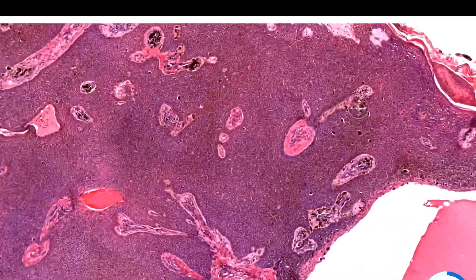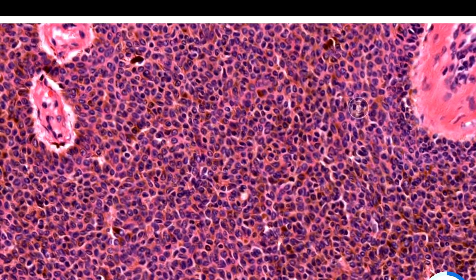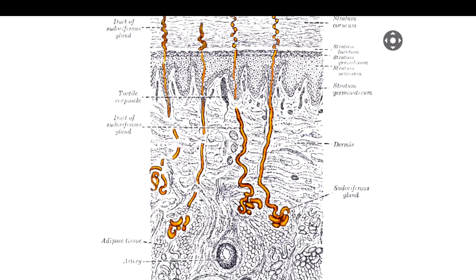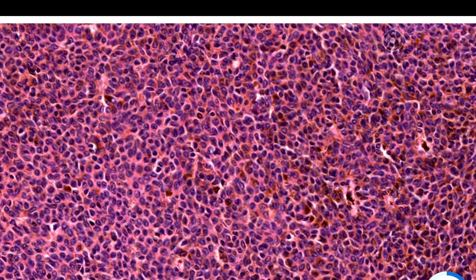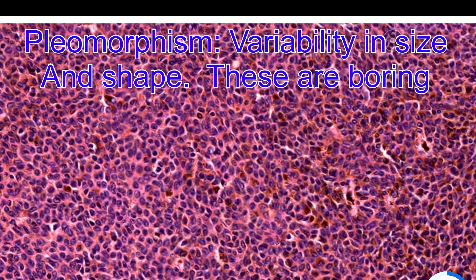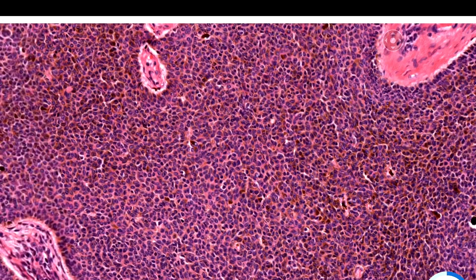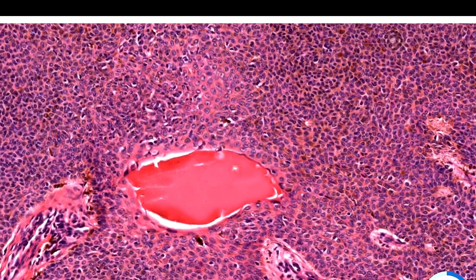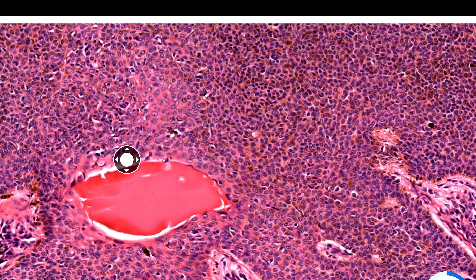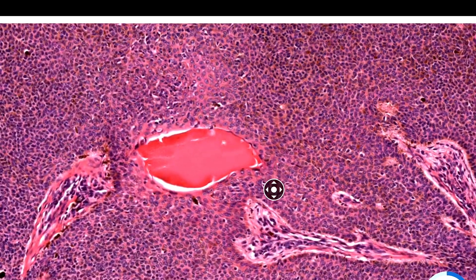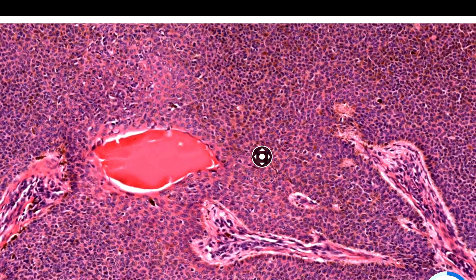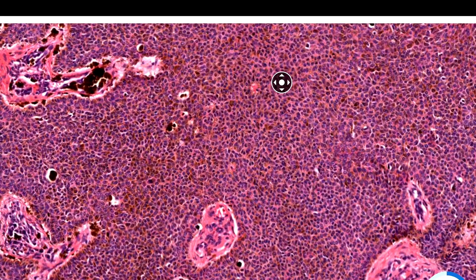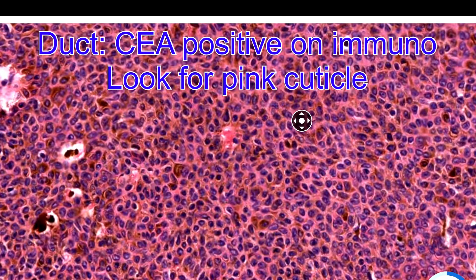At higher power, you can see very similar cells to the blue cells we looked at earlier. Scan around — they're sort of monotonous. You don't have too much pleomorphism, which means variability in sizes and shapes. In general, if you do see mitotic figures, they will not be atypical. Here's a structure — I'm not sure why it's so red in there, but I believe that's probably some kind of sweat or serum.